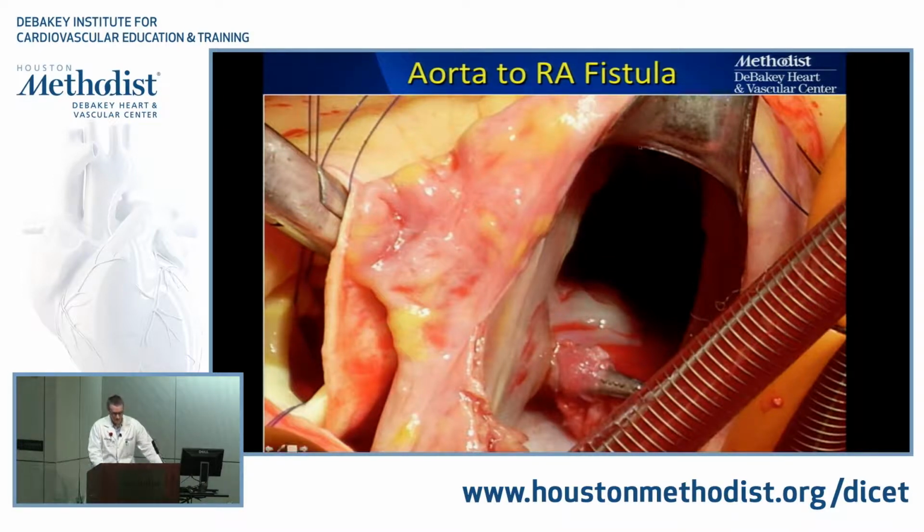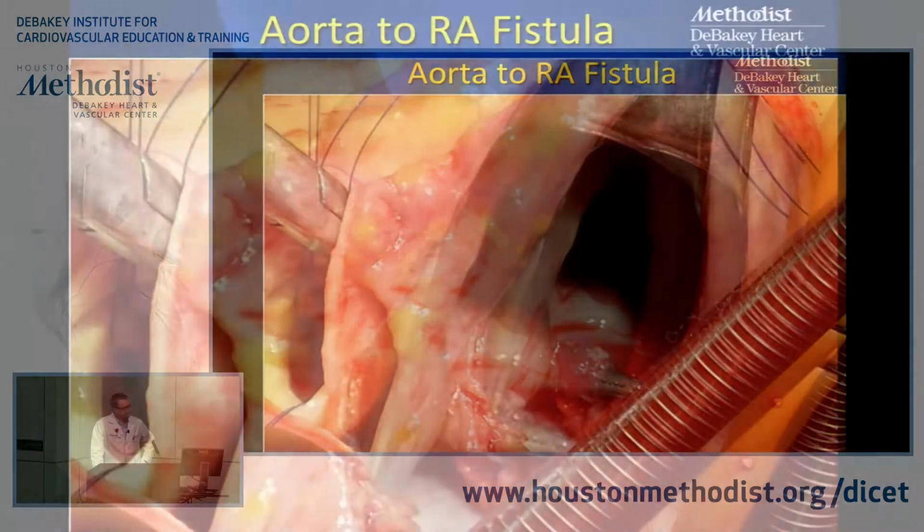So this is an example of a surgical tool down the ascending aorta, and then you follow a track that was evident, and it went from the aortic valve right into the right atrium. So an example of an aortic-RA fistula. And I'll show you a graphic at the end about some of this local destruction.